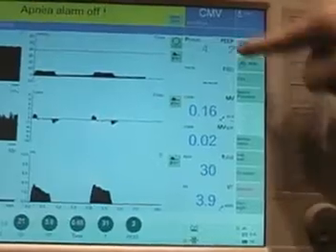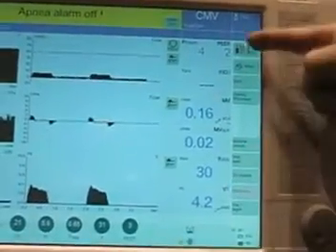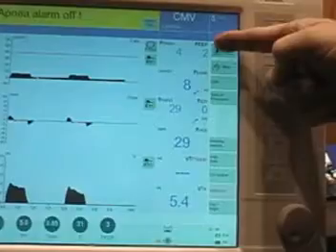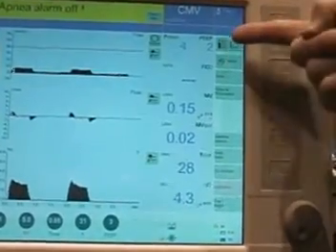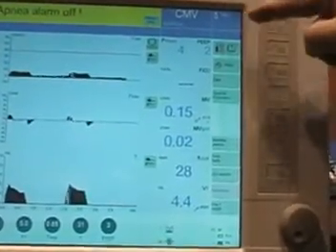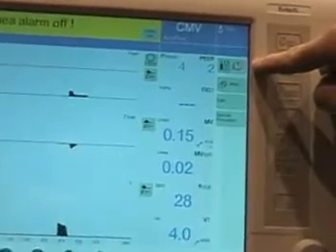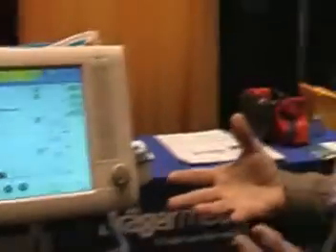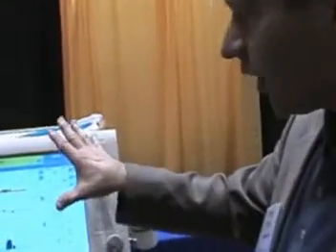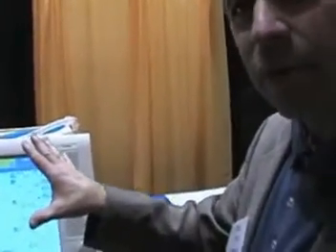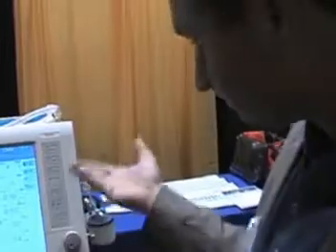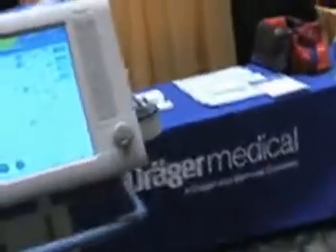Up here on the right you'll see indicators 1, 2, and 3 — you can have three different sets of parameter values. Beyond that, you can set up six totally different screens. So if a hospital has multiple care areas, you can configure the ventilator so each care area has its own complete set of parameters. Instead of setting up each time, it's all preconfigured — just bring it in and you're ready to go.